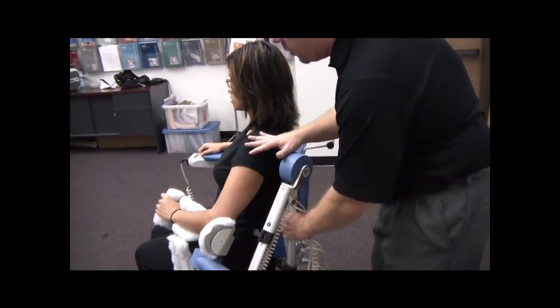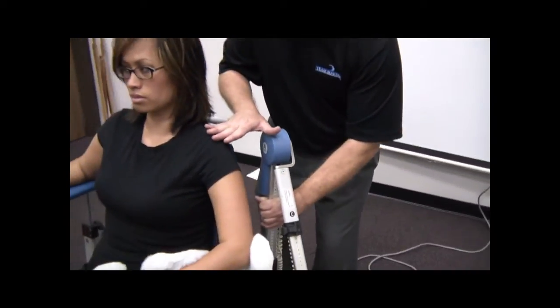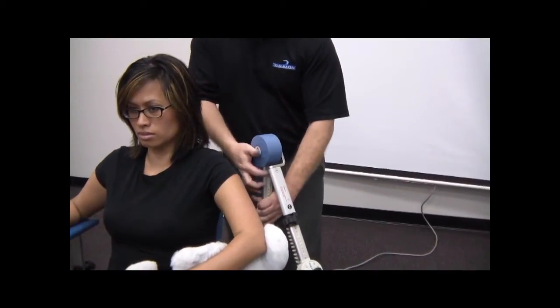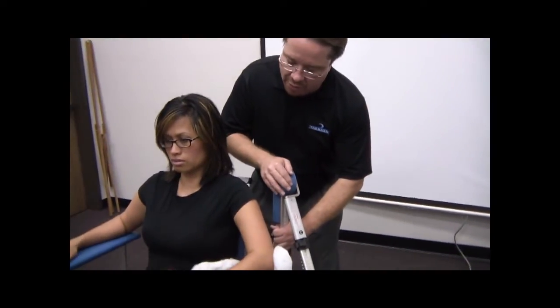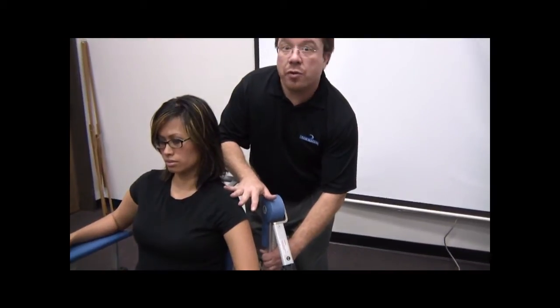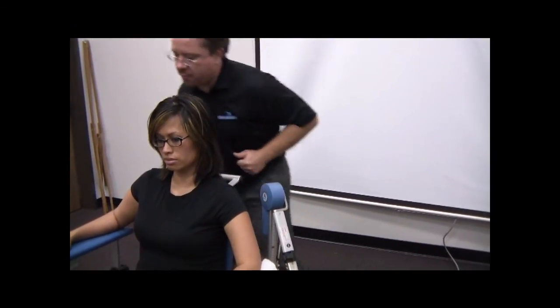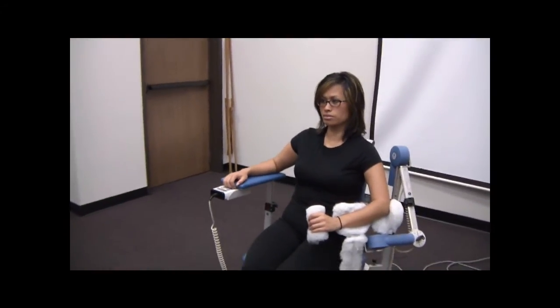Okay, so what we want to do, and I'll have you come around to the front of her there, I am going to lift this and I'm going to keep coming, and you see there, I am not only above her shoulder here, but you can tell that we're bringing her arm up into a shrugged position, which is not good. Now, if I keep going down, now I'm drooping her arm down, and that is also not good. So what I'm going to do is I'm going to find a comfortable medium, and I'm going to lock that into place. And now I'm going to take a look at her from the front, and I'm going to ask her, do you feel comfortable and even shouldered?